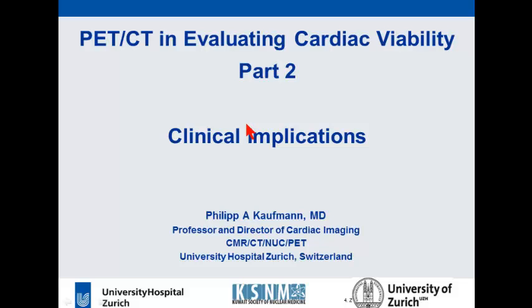But certainly for the heart, as the anatomy is not very complex, mental fusion or software fusion is perfectly good enough, and we do not need, for this kind of clinical application, one hybrid machine, which is very expensive and is time consuming or blocking one another. So we can do that on separate machines for sure.